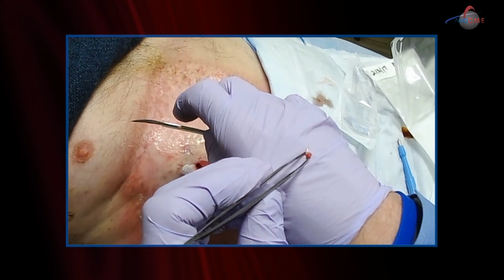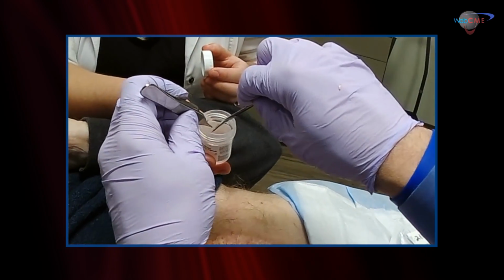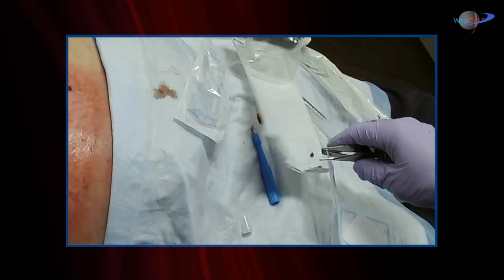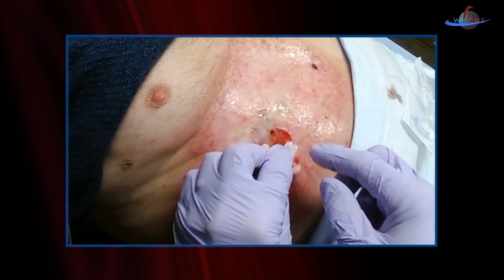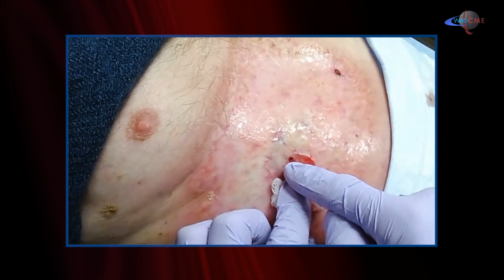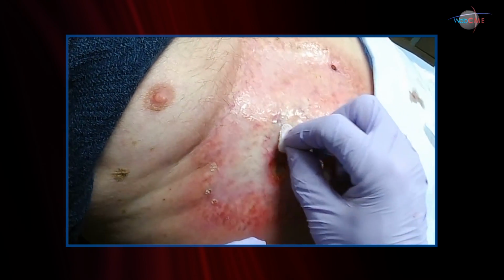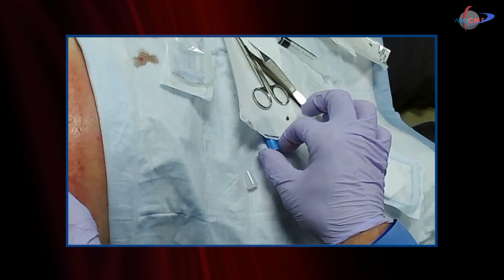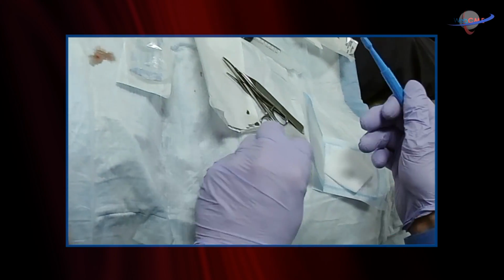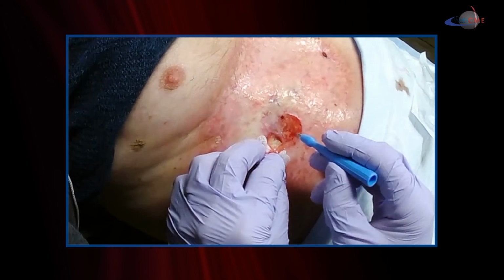This biopsy then gets transferred to formalin. Typically, hemostasis is achieved by just putting gentle pressure. You can see the biopsy site and the core where it's removed. You see it's not oozing, or only a little bit. And biopsy 1 is done. I do want to re-biopsy that other site, so we're going to use the instruments again.